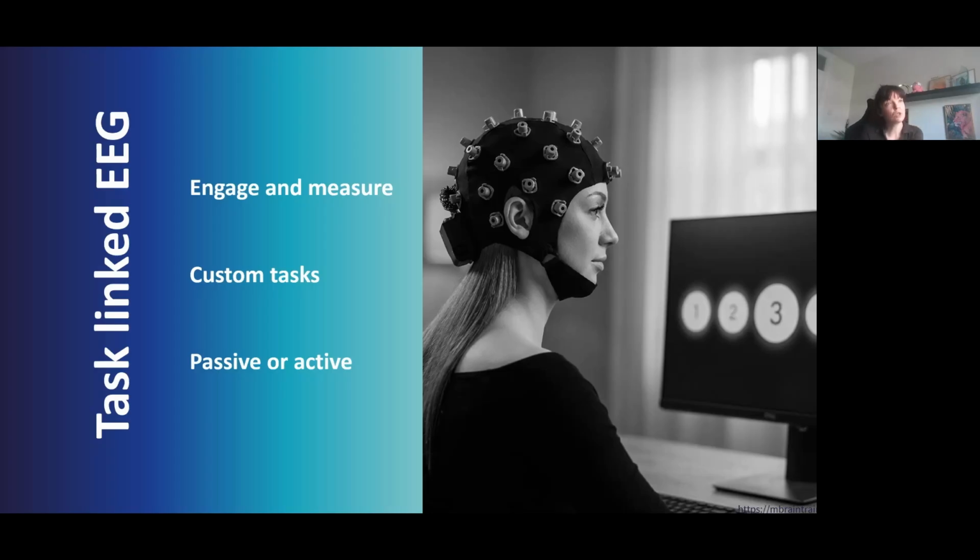These protocols are quite flexible in that tasks can be customized. You can add breaks in between parts of the task to suit the tolerability of your participants. And also, depending on what you're trying to achieve, tasks can be various degrees of difficulty. So we might have more active tasks where the participant has to perform different responses, or for some cases, we can use passive tasks. We deliver sensory stimuli, for example, to the participant, and the brain is engaged, but the participant doesn't have to actively respond, which can be a very nice thing to have, for example, if you're working with children or people with certain cognitive impairments.